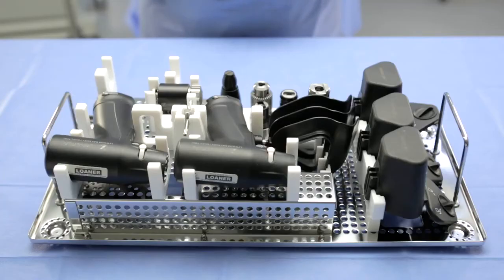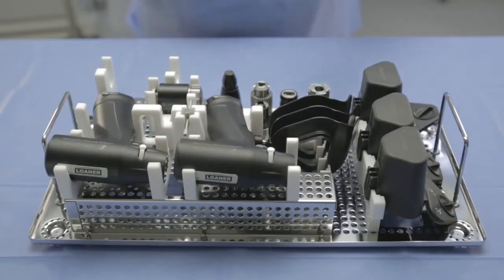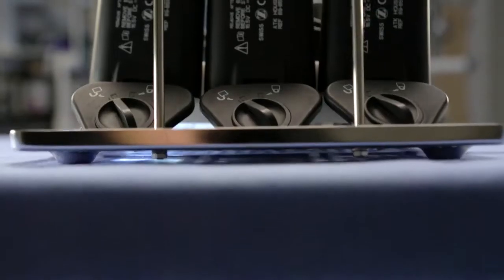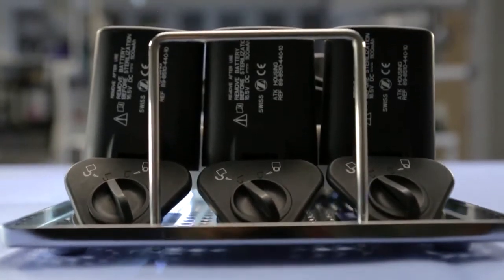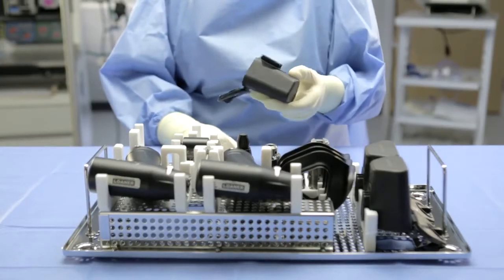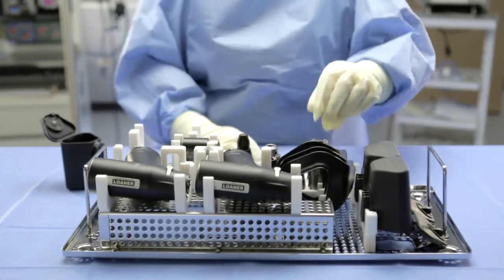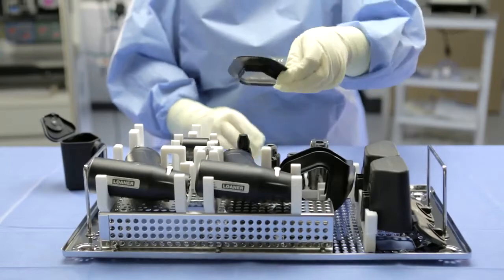You will need three components when utilizing the aseptic battery option to power the Universal Power System, including the red aseptic battery, the sterile battery housing, and the sterile transfer sleeve, both contained within the sterilization case. The scrub should remove the battery housing from the sterile tray and ensure that the door is fully open and in an unlocked position. The scrub should then remove the transfer sleeve from the sterile tray.